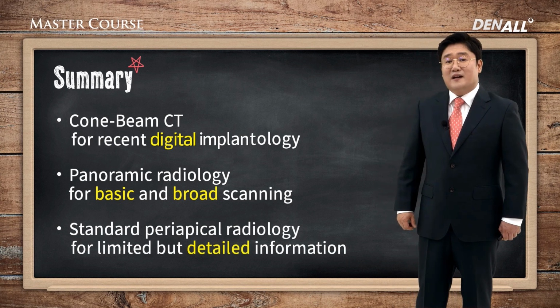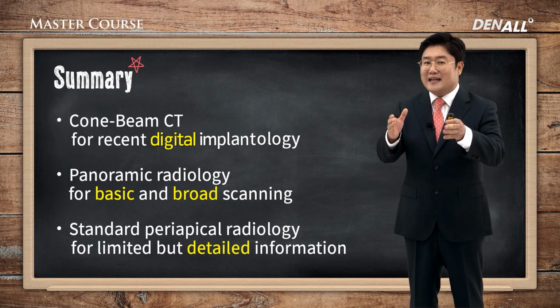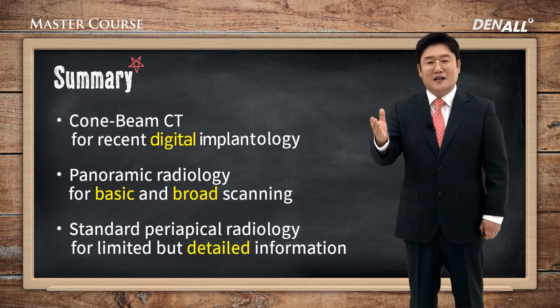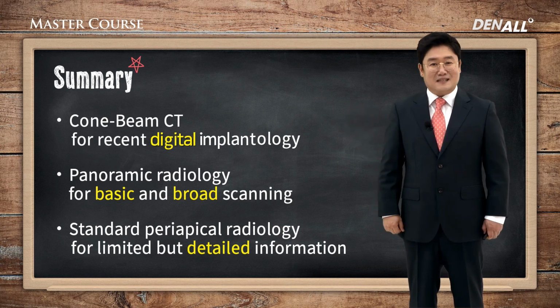Standard periapical radiology has the disadvantage of limited coverage, but it gives detailed information. Therefore, in the age of digital CBCT, this is absolutely necessary.